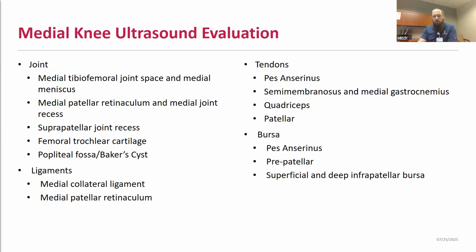And then looking at the medial patellar retinaculum and the patellofemoral joint as well along that medial recess, and then going more into the anterior aspect of the joint and that suprapatellar recess. And so in addition to the evaluation today, we're going to talk a little bit about some of the anterior knee structures as well, including the quadriceps and patellar tendon, patella itself, and the associated bursa, as well as the hyaline cartilage of the knee, and then dive a little bit into some of the posterior medial structures, such as evaluation for Baker's cyst and taking a look at the posterior medial tendons, such as the semimembranosus and the medial gastrocnemius.